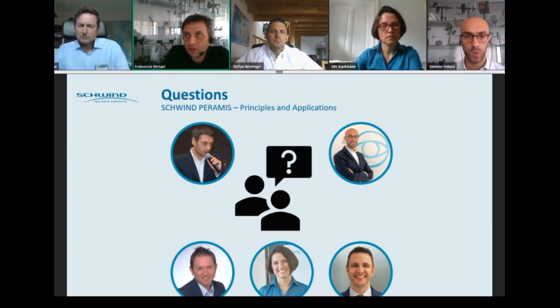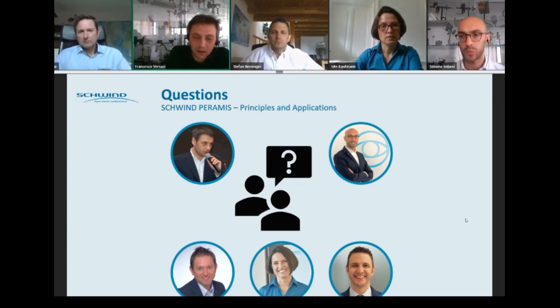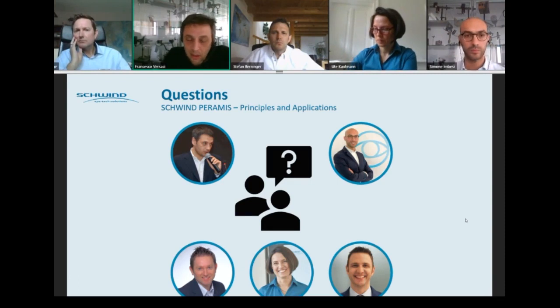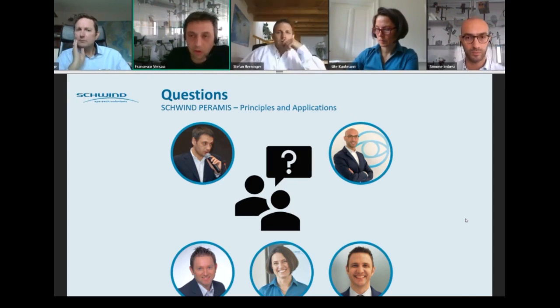what simulation has to be treated, we should introduce the concept of metric of the wavefront, because we have to understand what it means to have a good wavefront or a bad wavefront. Usually, something that is done is to check the quality of the PSF. The PSF is the simulation of how a light coming from infinity hits the retina. So if I have a small spot on the retina, the vision will be good. If I have a big spot, I will have a blurred vision.